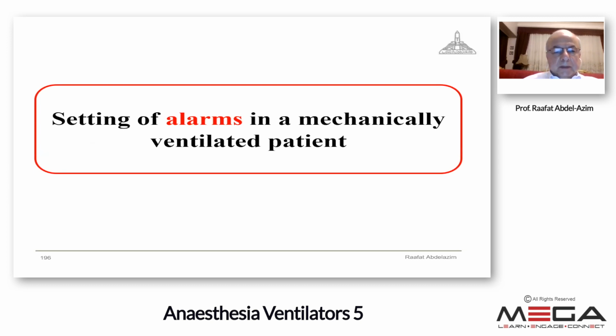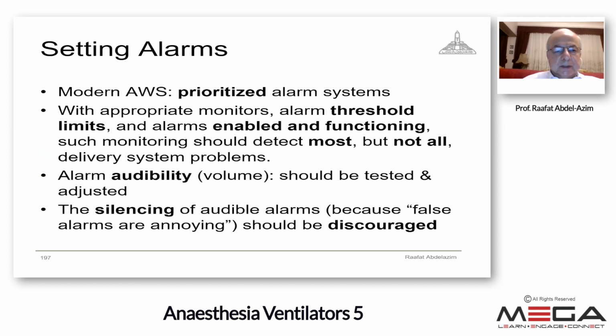Today, I will give a hint about how to set the alarms in a mechanically ventilated patient. Alarms in modern ventilators are prioritized.